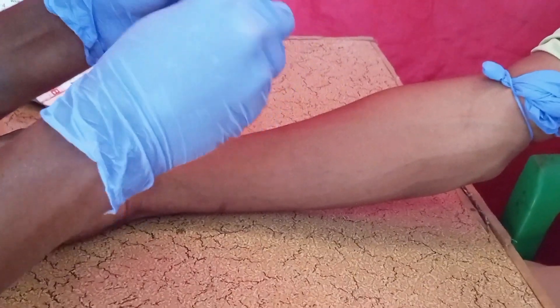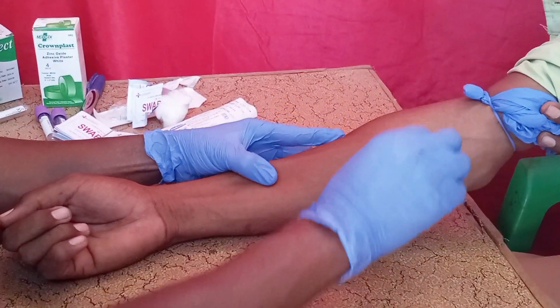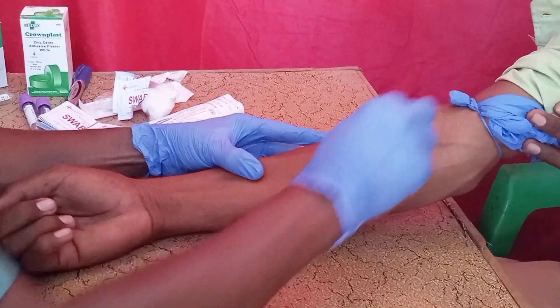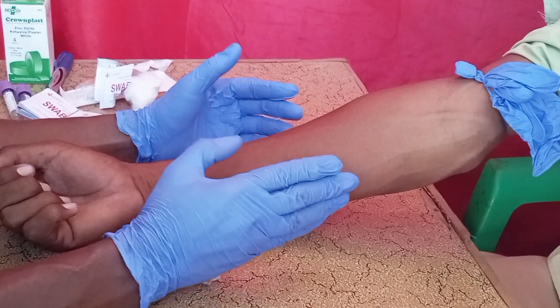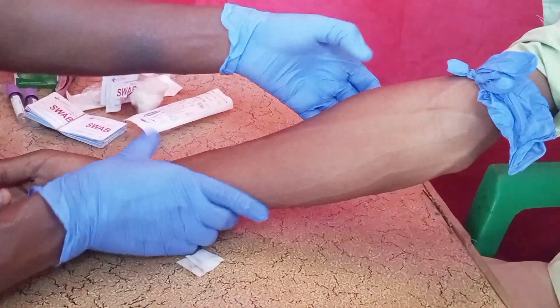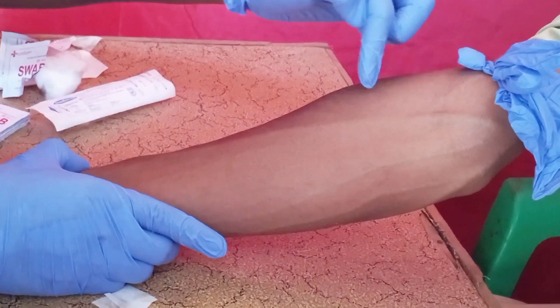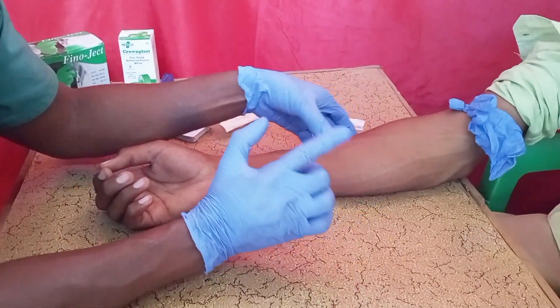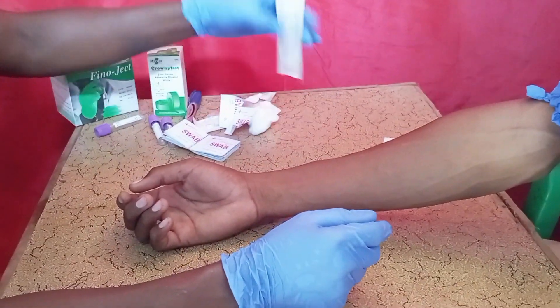When you apply the tourniquet, clean the vein first before drawing the blood using an alcohol swab. Allow the skin to dry first. You can see now the vein is very visible — this is the antecubital vein. After applying the alcohol swab, allow a few minutes for the skin to dry.